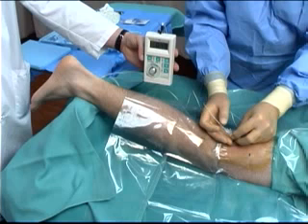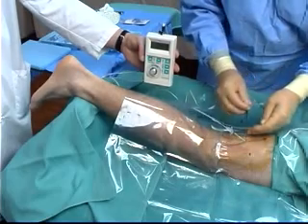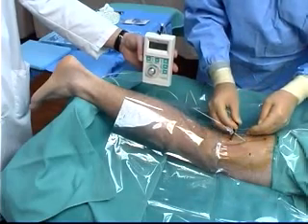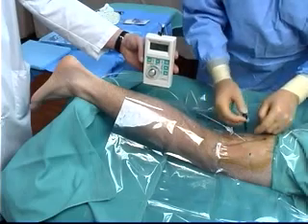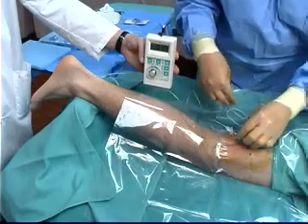The catheter can be advanced for 3 to 5 centimeters along the nerve. Advancing it further than 5 centimeters may cause the catheter to coil up and even coil around the nerve. This has never been described, but it is a theoretic possibility. Remove the needle without disturbing the catheter. If the catheter is now left in this position, it will almost certainly dislodge, and it should be tunneled subcutaneously.